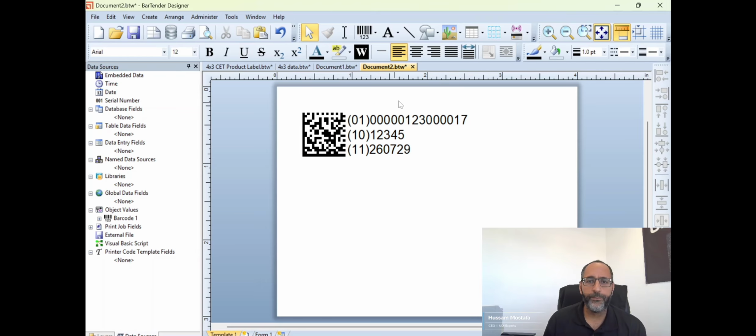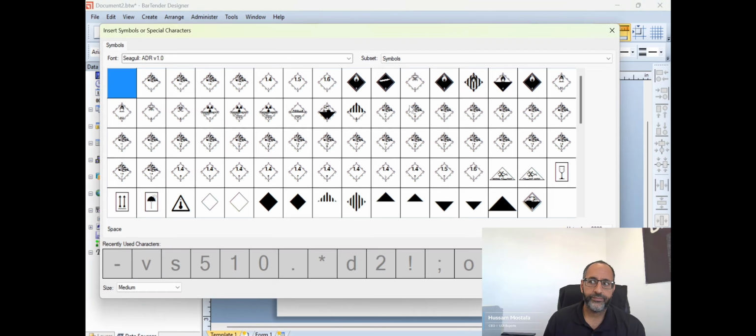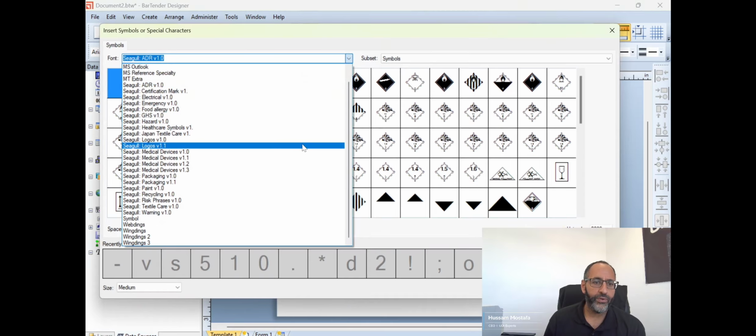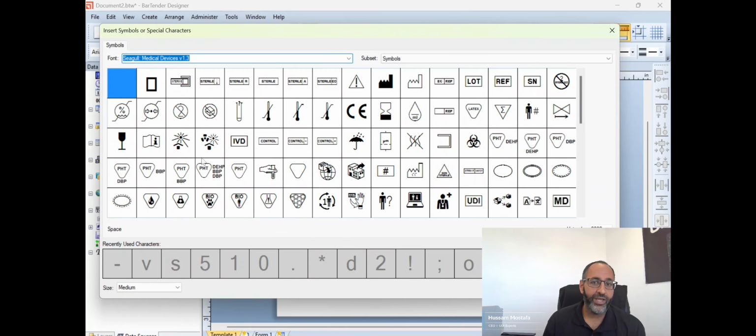Now we could go ahead and throw some medical device symbols in there. And so we could click on this A text right here, choose symbol, font, character. And then in this BarTender tool, they show the symbols by these items here. You got the Seagull medical device version 1.1. You have the 1.0, 1.1, 1.2, and 1.3. So let's just go ahead and click on the latest one, version 1.3. And now we have all these medical device symbols per ISO 15223.